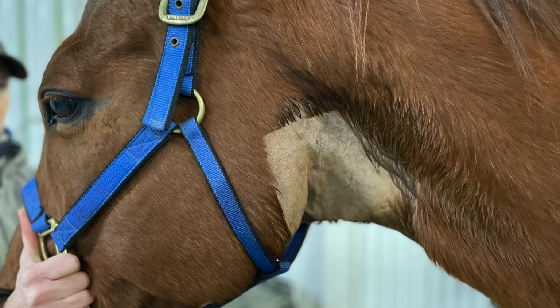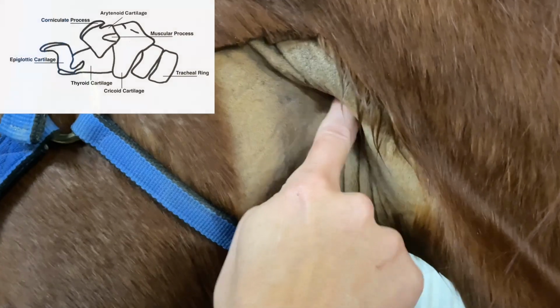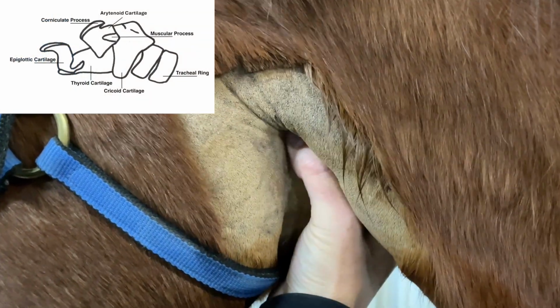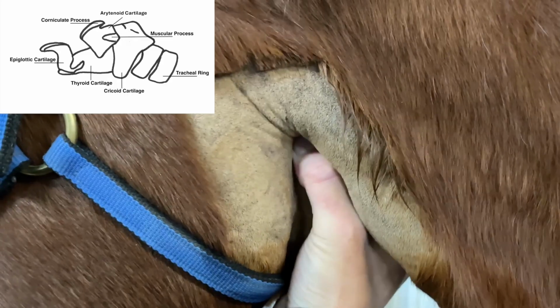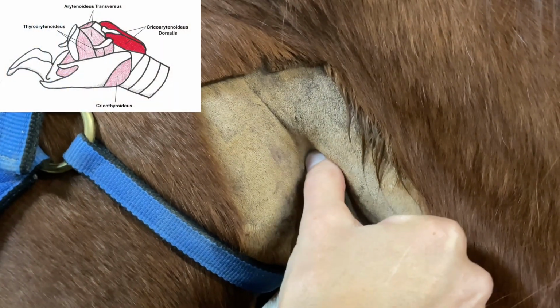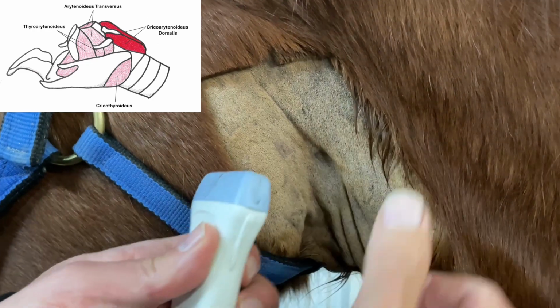Secure the horse in the stocks and clip the left side of their larynx from approximately their second tracheal ring to overlapping the caudal aspect of the mandibular bone. Start by palpating the larynx to confirm normal anatomy. Identify the dorsal aspect of the larynx, then the cricoid cartilage. Moving slightly rostral, you'll feel the thyroid cartilage.